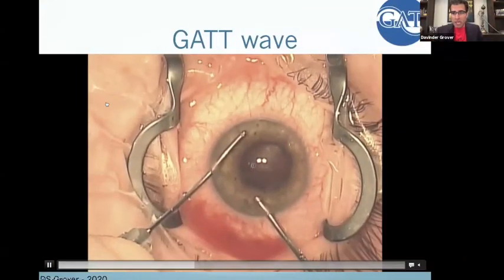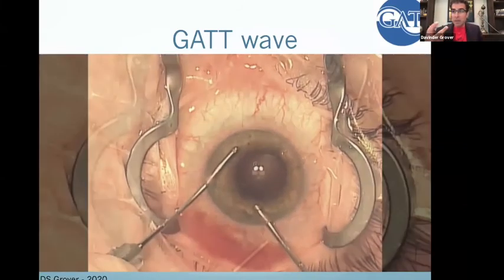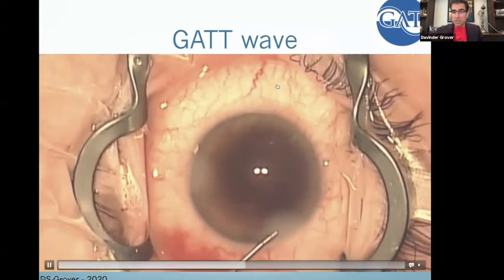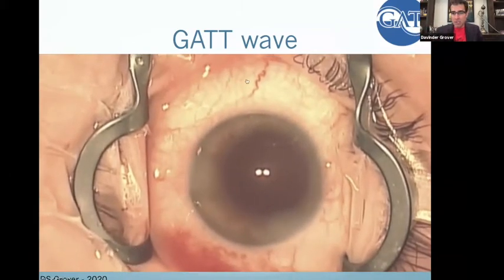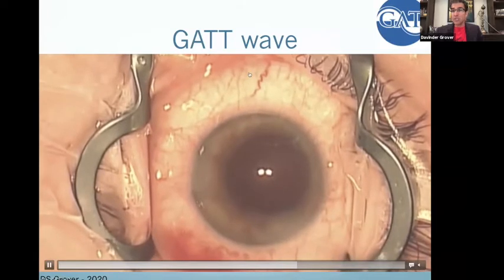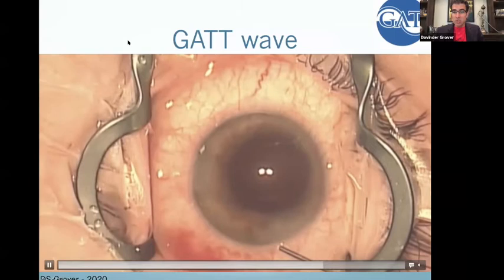We let it go in real time. I'm just going in and out and irrigating, and then I'm going to pump up the eye really high, when the pressure is going to be 30. And you can see there's almost like a lavage, or you're cleaning out the collector channel system. And this, we found, is a very good sign, right? But we didn't know that when we first saw this, what we assumed it was.